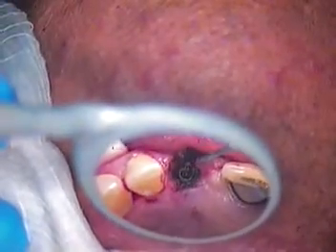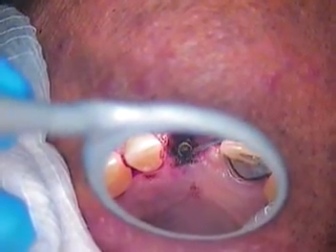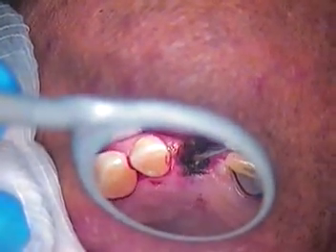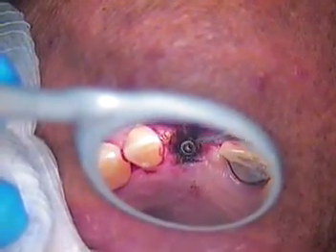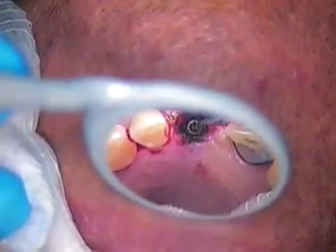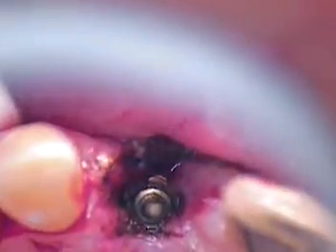I'm going to back off the magnification and just go straight in. The power of the microscope, we are right about 3.5 now. We'll take it up to 8 and 12.5 power. Alright, we'll do one more scrub again.